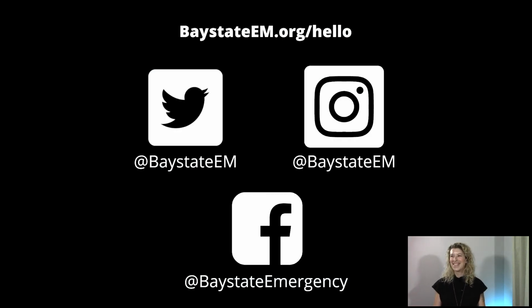Dr. Sterling, thank you so much for that comprehensive review of all things gallbladder ultrasound. I just had a quick question, if it's okay with you, about that last case you mentioned. I think you might have addressed it earlier, I just wanted to clarify. Showing the elderly woman with the obvious pathology in her gallbladder. So that's a patient you would still get a CAT scan on, even though you feel like you found the answer to what her source of sepsis and illness is coming from.